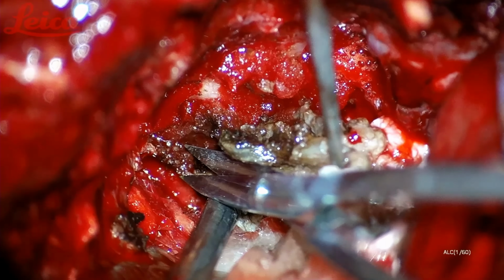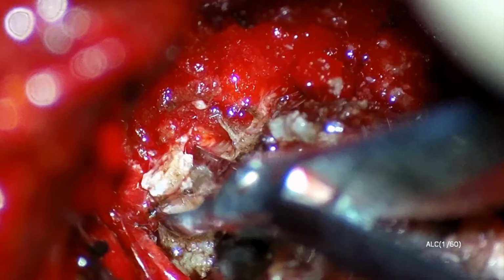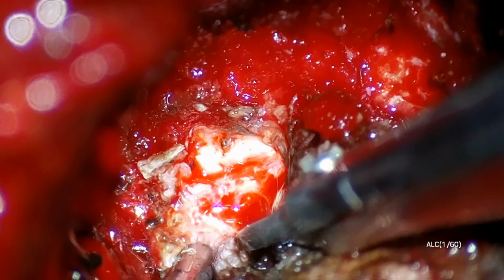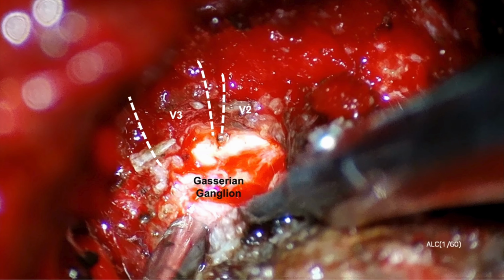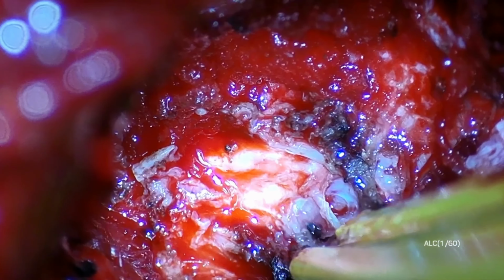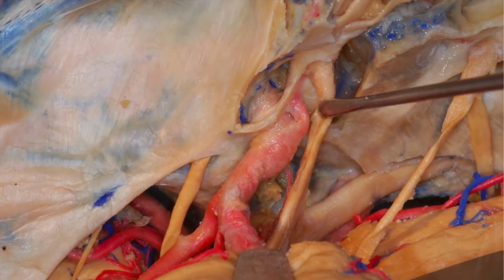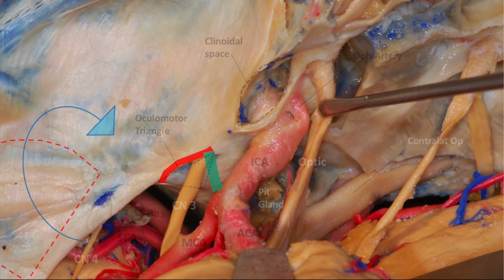the trigeminal nerve can be fully decompressed, and tumor invading the Meckel's cave can be resected with minimal blood loss and adequate visualization of key neurovascular structures. Likewise, this medial dissection is carried down over the tentorium in the direction of the oculomotor triangle, which is the point of compromise of the third cranial nerve in this case.